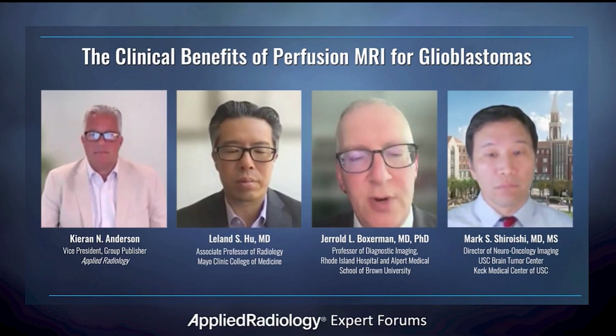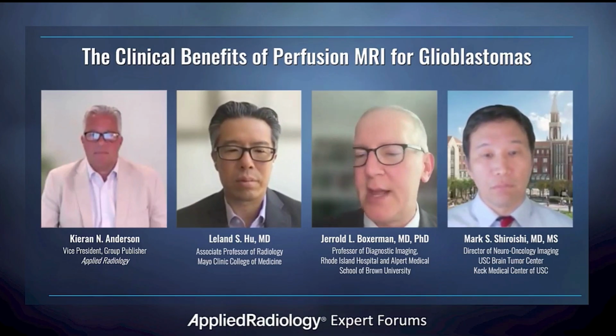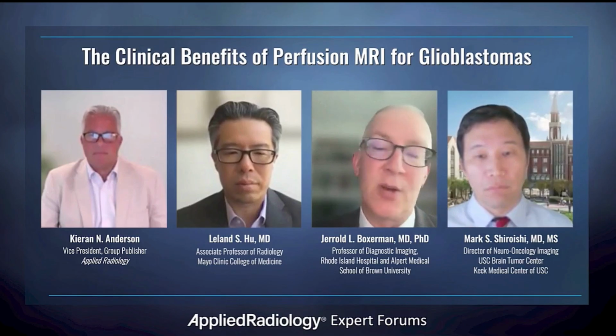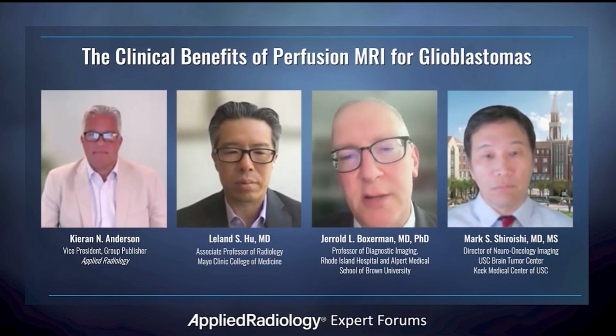It doesn't require any extra contrast administration. Imaging time is only increased by the few minutes it takes to acquire the dynamic imaging. So there's really not much extra resources or imposition to the patient. So I guess the short answer is that it really is safe and doesn't incur any additional cost.